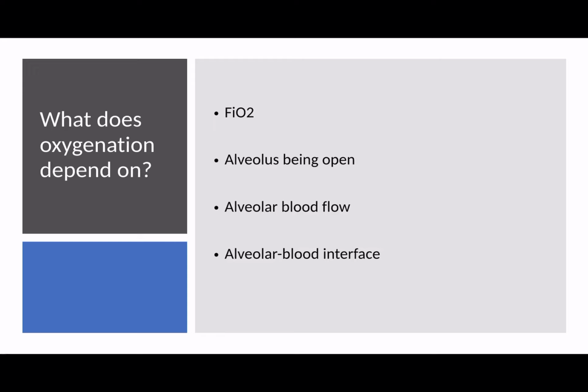And as such, there is the concept of PEEP, positive end expiratory pressure. This is very simply a pneumatic splint, a way of keeping the alveoli open during the expiratory phase for the patient.